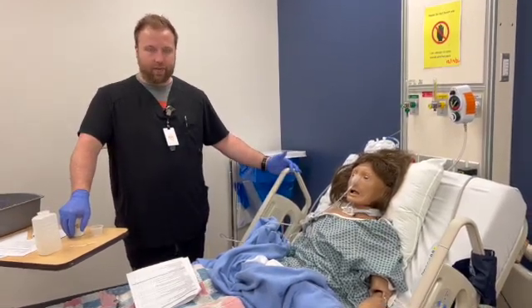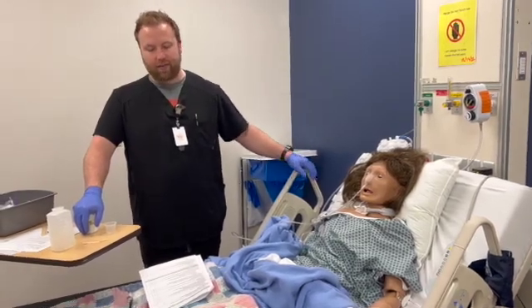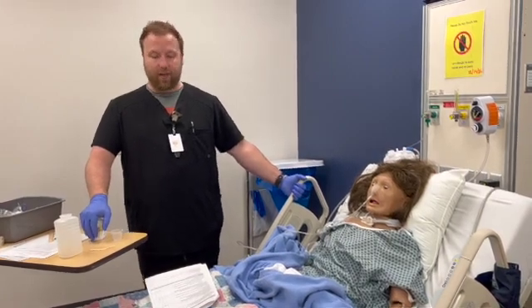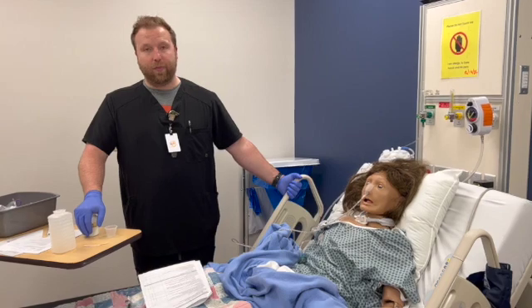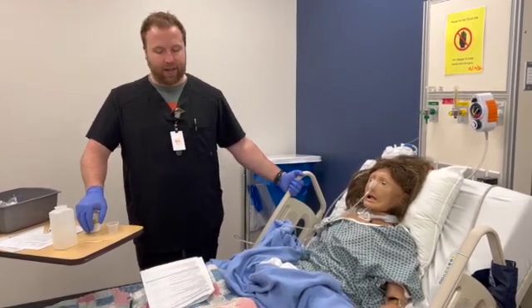We're still going to follow those 6 rights in medication administration: right medication, right dose, right patient, right route, right time, and right documentation. We still want to be talking to Stan and letting him know why we're giving the medication, the name of the medication, and what side effects the medication might have.